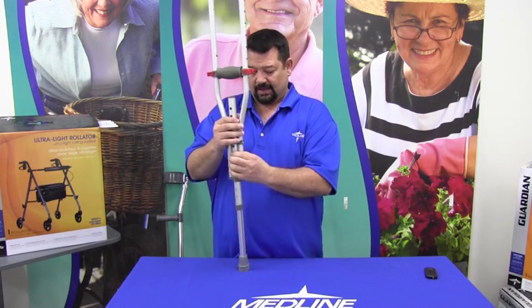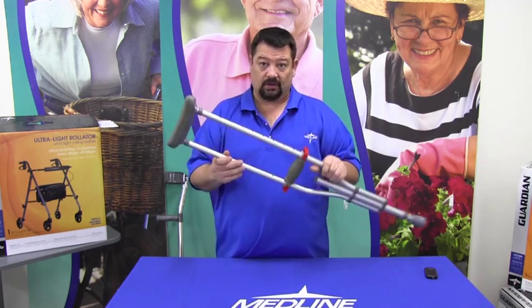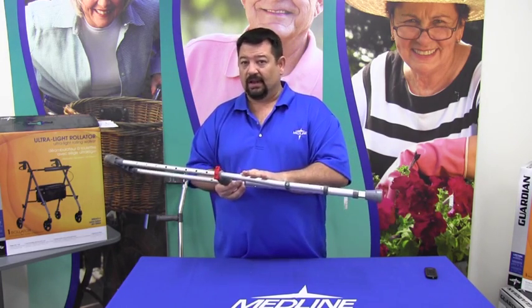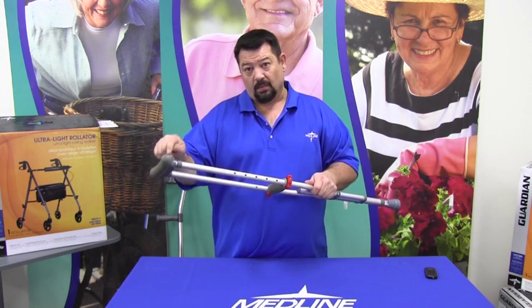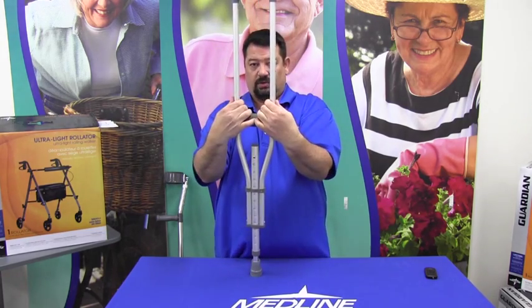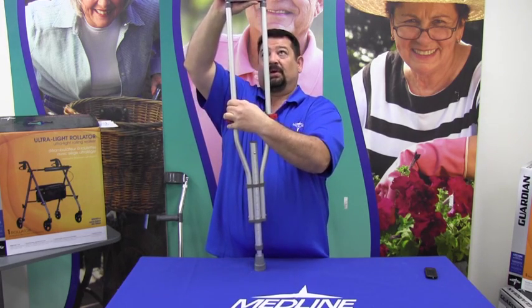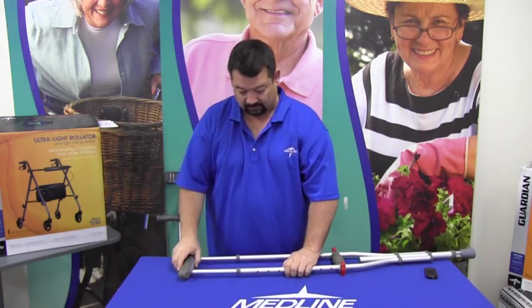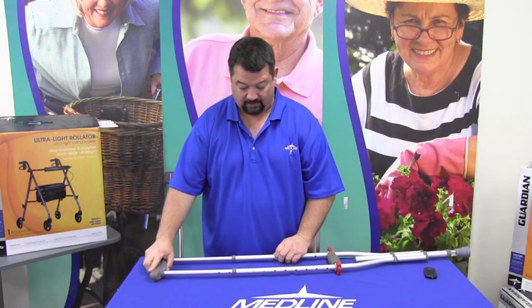Now, the interesting thing about this particular crutch, because it's a universal, like I said before, it has multiple layers of adjustability. This is one. Well, the arm pad is another one. And if you look inside the tube here, you're going to see a series of buttons. What you need to do is push that button in and lift. And now the axilla support actually extends out farther.